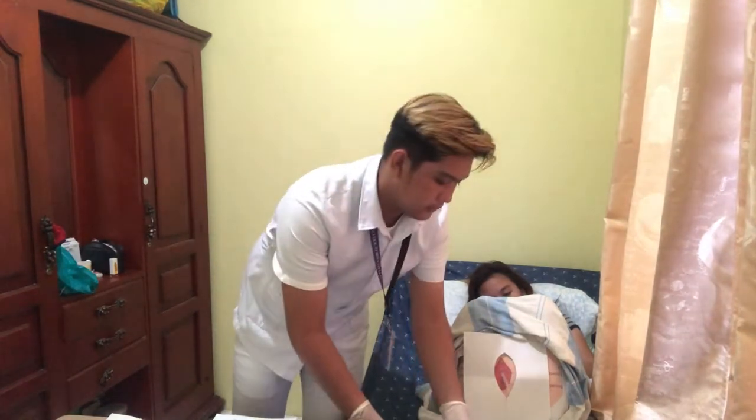Okay, so we'll inflate the balloon with 10 to 15 cc of sterile water using a 15 to 20 cc syringe. Inflating the balloon will prevent the catheter from slipping out of the body.